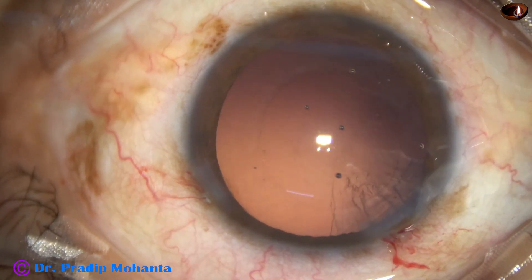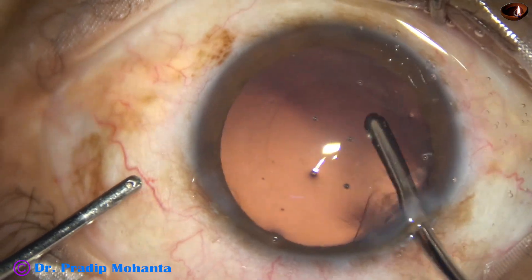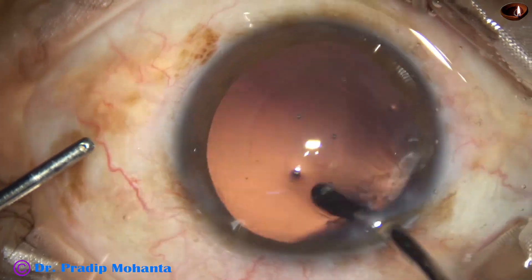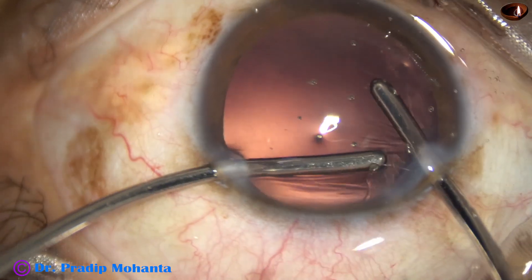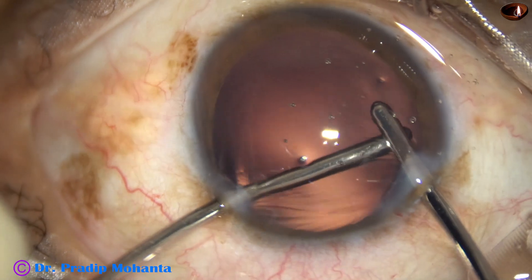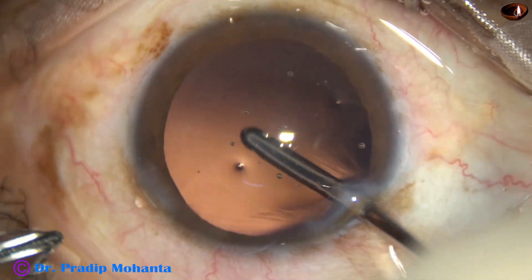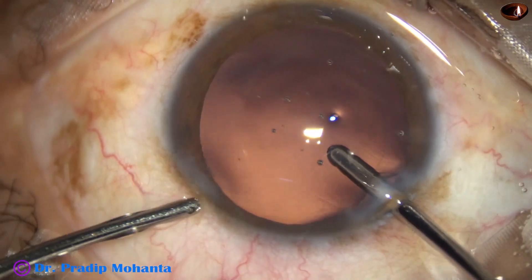This is a totally unedited recording and you are not missing anything — real speed, unedited video. Now the irrigation probe lifts the anterior lip of the main wound and the aspiration cannula removes the sub-incisional cortex.